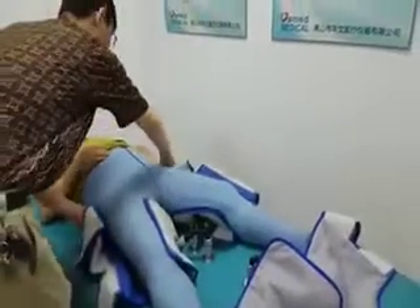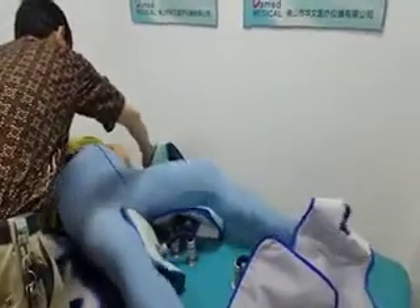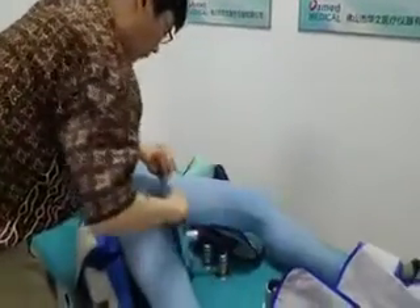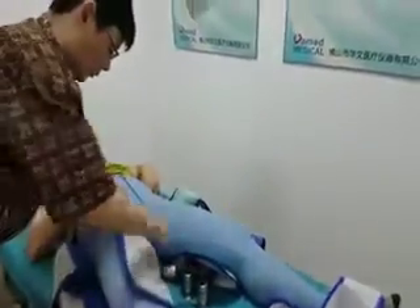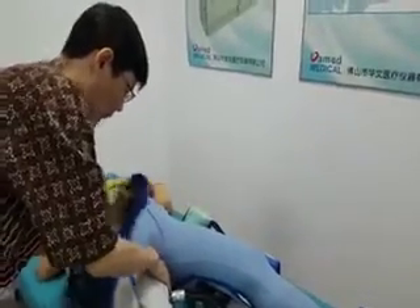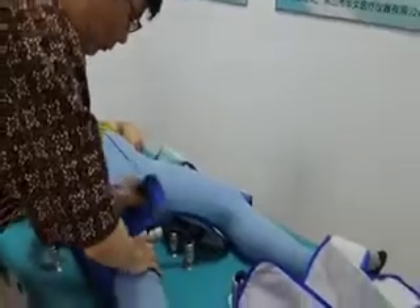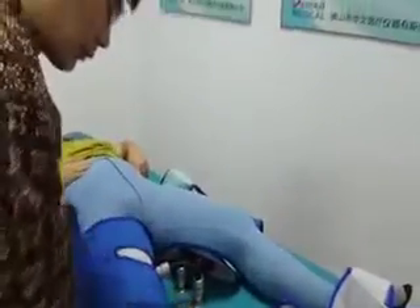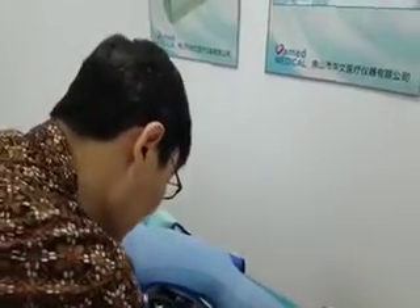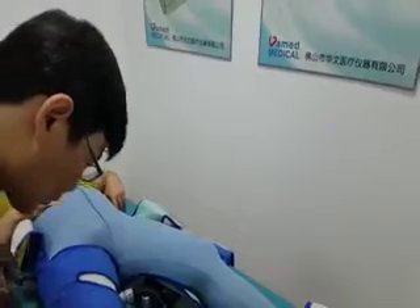Now let's start treatment. Please ask the patient to lie down on the treatment table. Remind the patient to go to the toilet before wrapping the cuffs. Wrap the cuffs on the patient in the order of lower side, calf, and upper side, and connect the hose last.